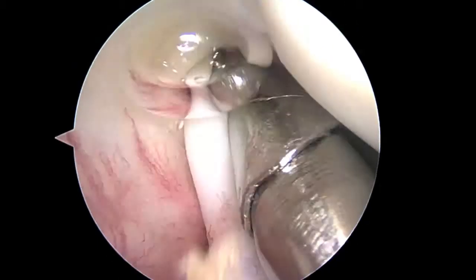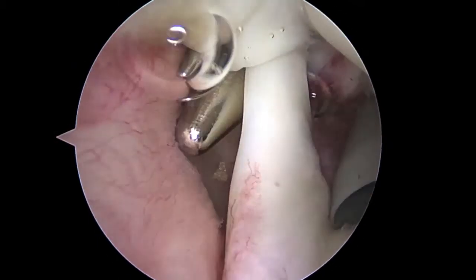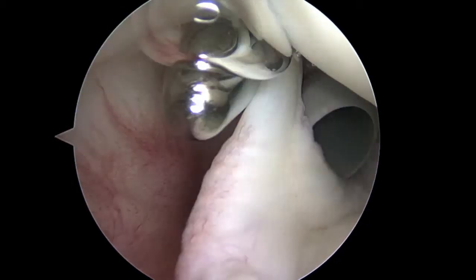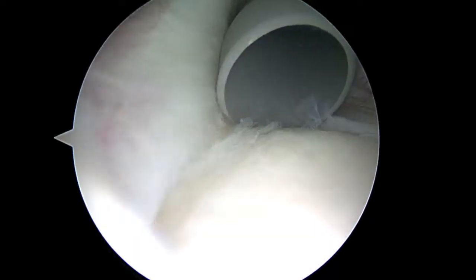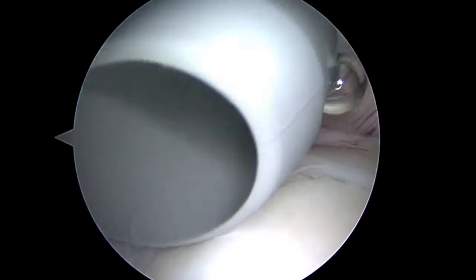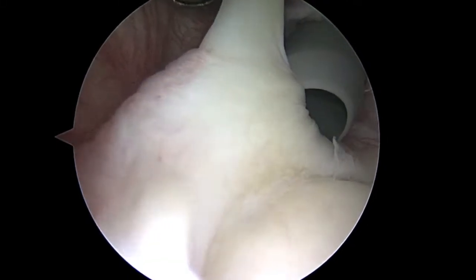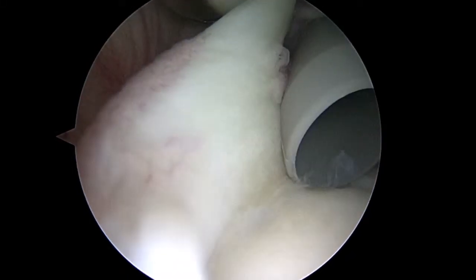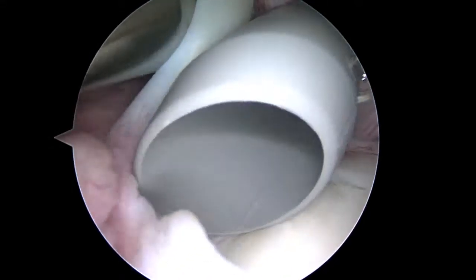Here's your bicep tendon here. We'll remove this metal cannula so it's behind the biceps, like that. Then we have another gray plastic cannula coming in here. And what we're going to do is look at the biceps anchor. It's a little bit frayed, but it's really not loose, which is a good thing. You can see that right now — looking down at 6 o'clock on the screen, just below the gray cannula. A little frayed, but not loose.